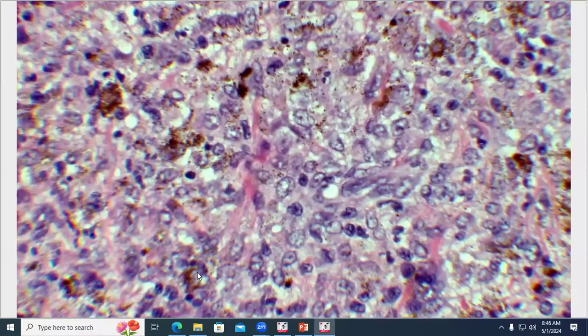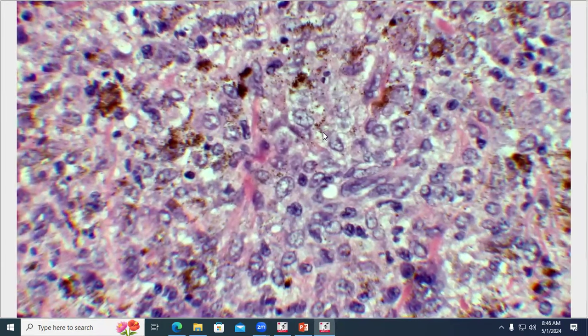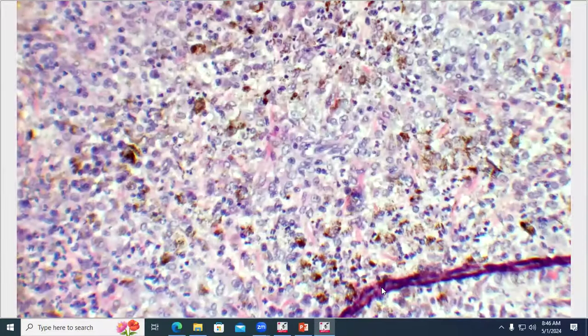A few of the clusters, they surround nuclei kind of like that. So they're inside cells. More specifically, they're inside macrophages. So these are melanomacrophages, right? So we call this pattern a pigment peppering, like you're just throwing melanin in the background. So there's disruption of the melanin.